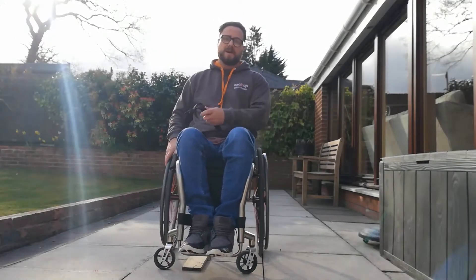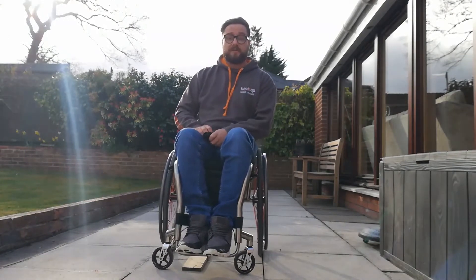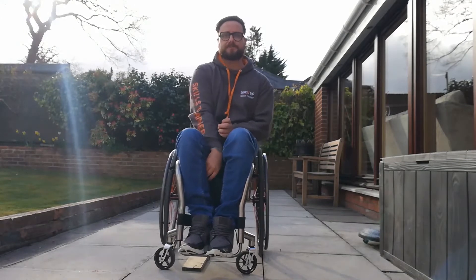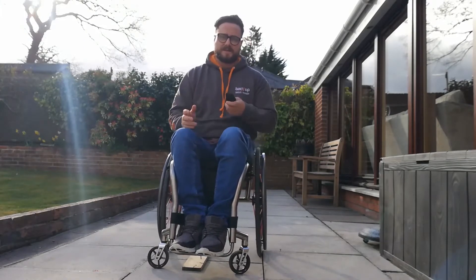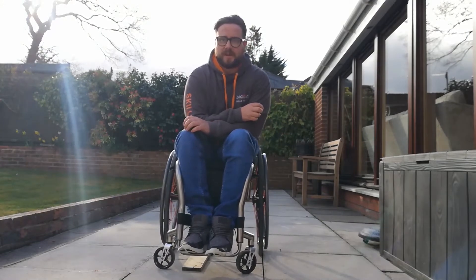Hi guys, it's Rich from Backup again. I just wanted to use this next little video to talk about thresholds and how we negotiate those in our wheelchair. We find lots of thresholds out in the community, out in everyday life.